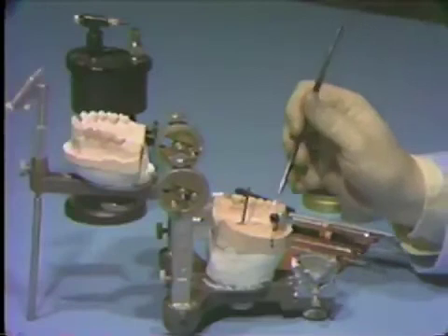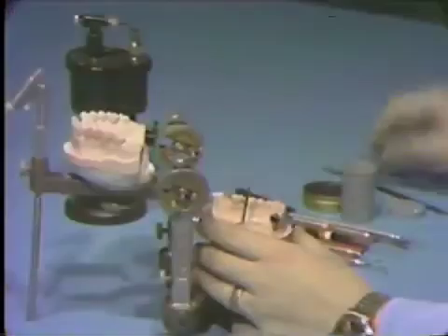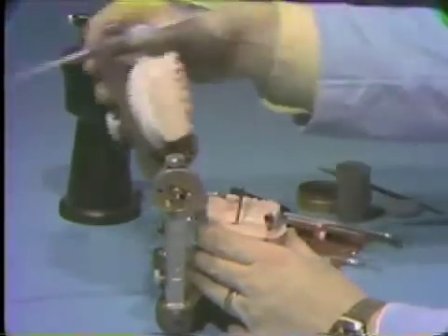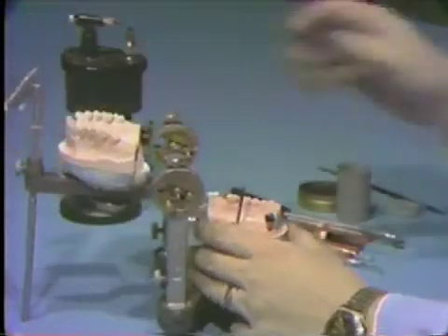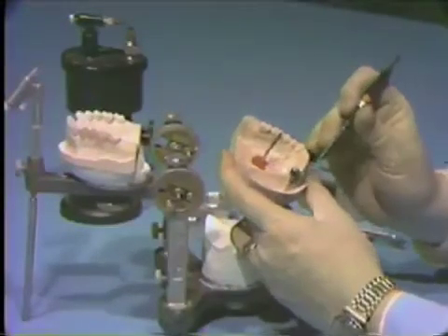Finish the wax up to the normal tooth contour. The wax up should be checked by brushing zinc stearate powder over it, closing the articulator and checking the occlusion. Then check the wax up for contact and contour, specifically in the buccal and lingual areas.